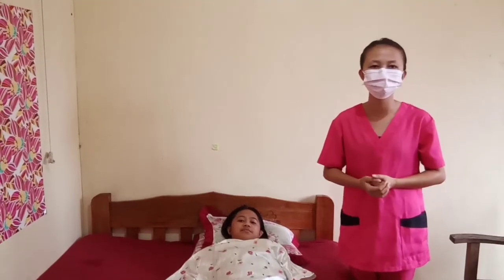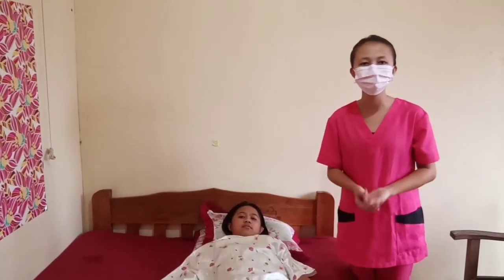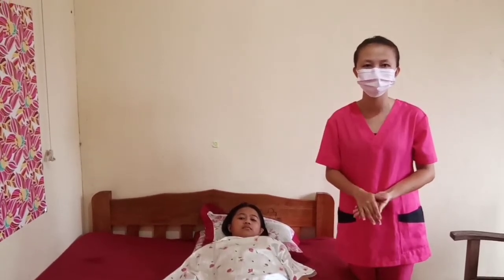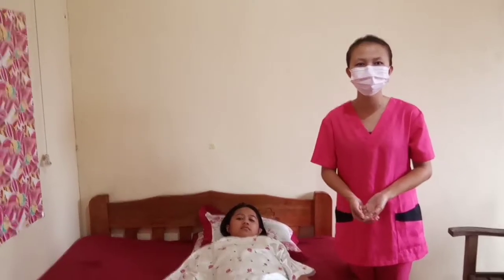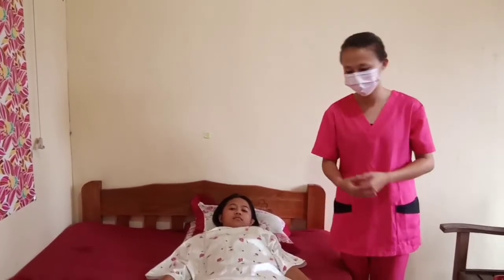Good day, ma'am. I am Julian Luyas, and today I'll be performing wound care. So first thing to do is review medical orders for dressing change procedure. After that, explain procedure to client and instruct client not to touch wound area or other sterile supplies.